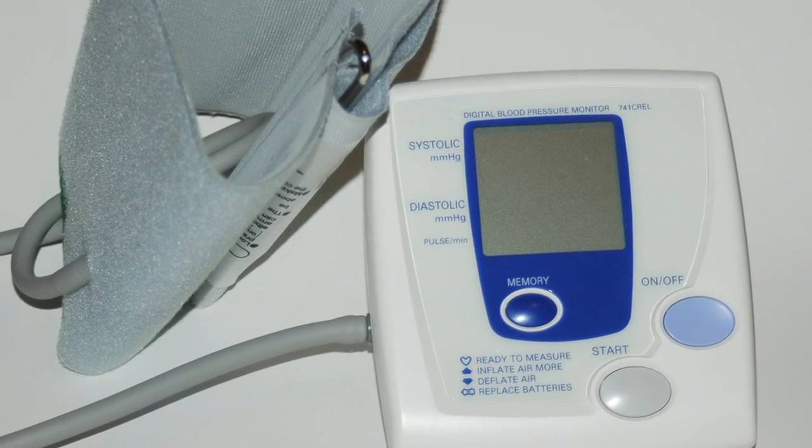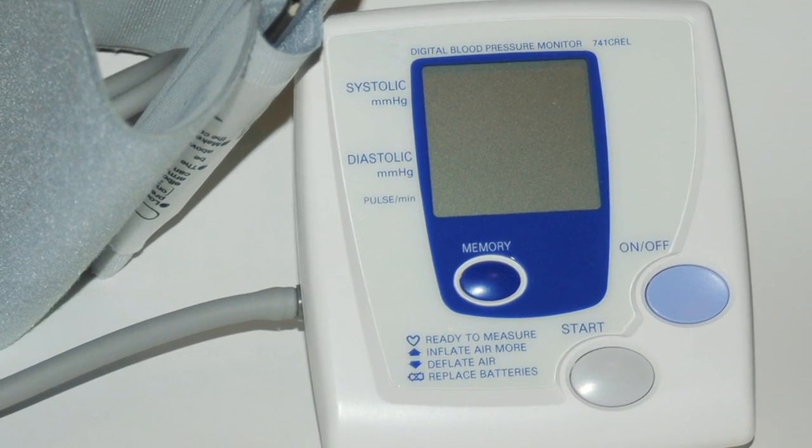One that's growing more and more popular is an electronic device that has an automatic blood pressure cuff. The device pumps air into the cuff and then a sensor within the device listens for the sound of heartbeats in the vessel, usually the vessel of the arm, as the blood flow returns. The computer listens for those sounds and calculates an appropriate blood pressure.